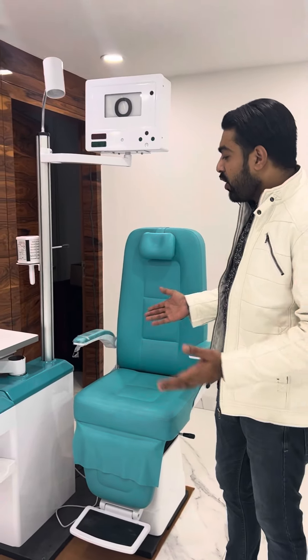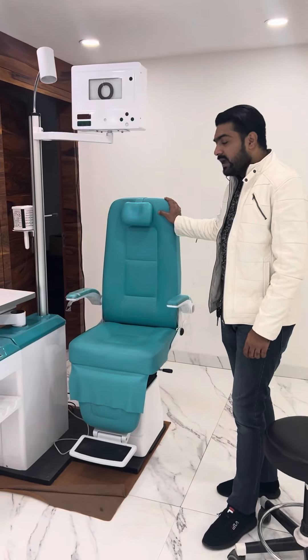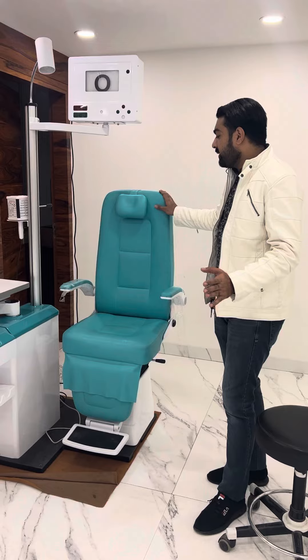Today we are going to show you the optical chair unit. In this case, you have two models: one is the doctor model and one is the optical model.